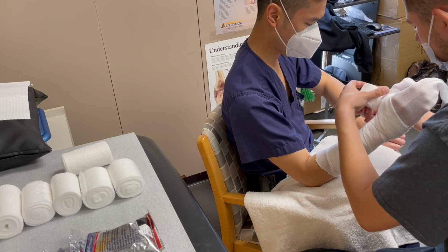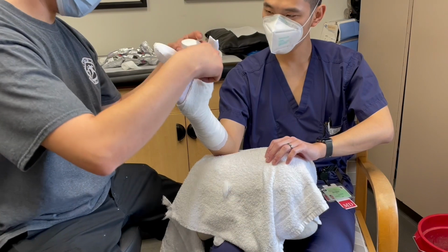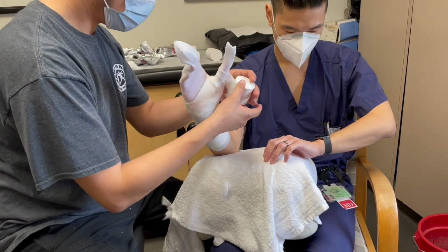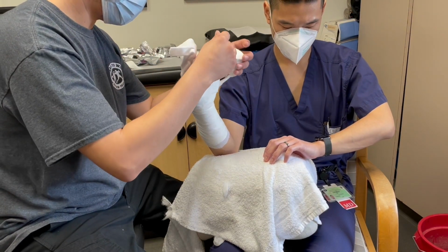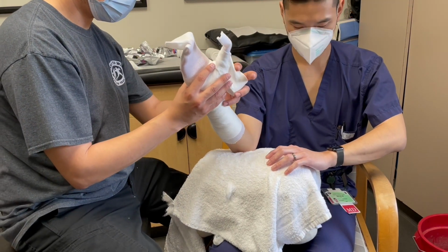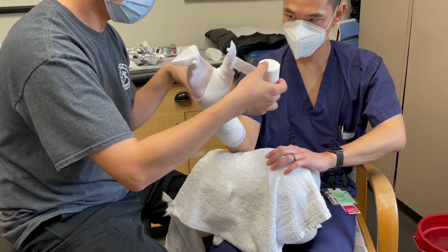In this portion of the video, we are layering the padding for the thumb spica. The thumb spica cast should cover the interphalangeal joint of the first metacarpal and extend up to the proximal third of the forearm. The wrist should be in 25 degrees of extension with a thumb in a position of function.